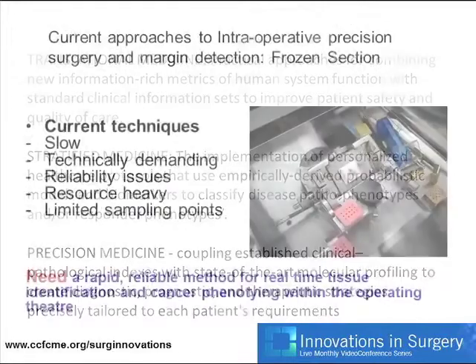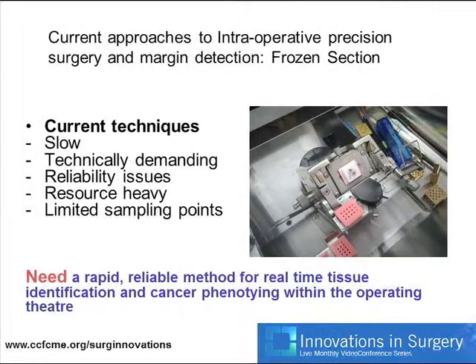Next slide. So intraoperatively, of course, it's tempting to make the assumption that precision medicine simply means making more accurate cuts with a knife? Well, it kind of does to a degree.